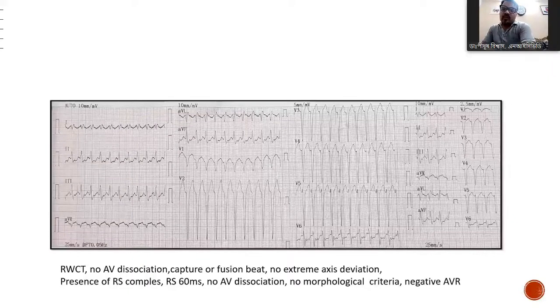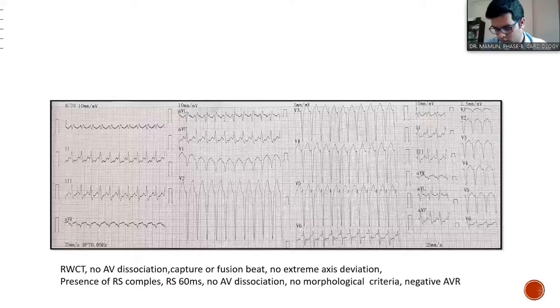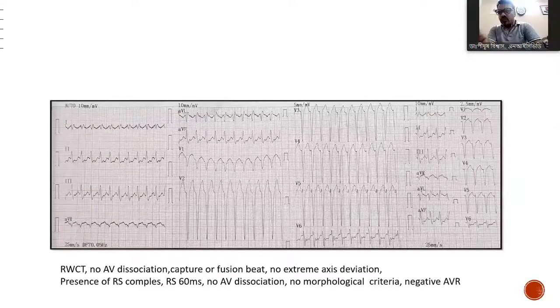Dr. Mamun, you showed 3 ECGs. All are wide complex tachycardia, but regular wide complex tachycardia. Please tell me the causes of irregular wide complex tachycardia.